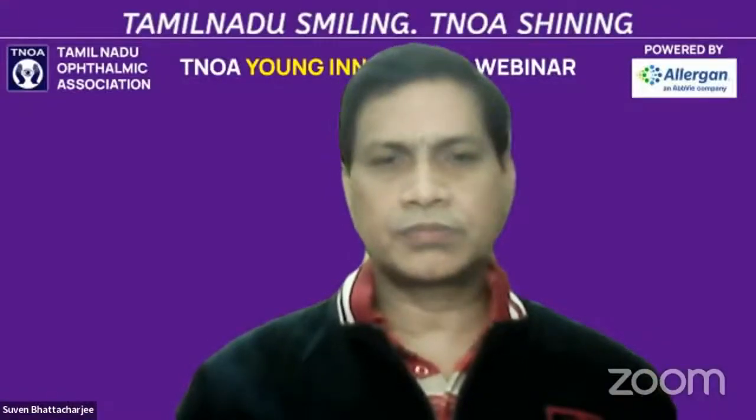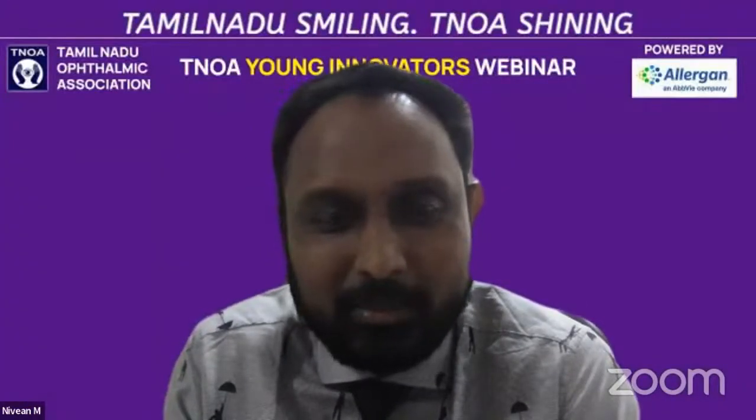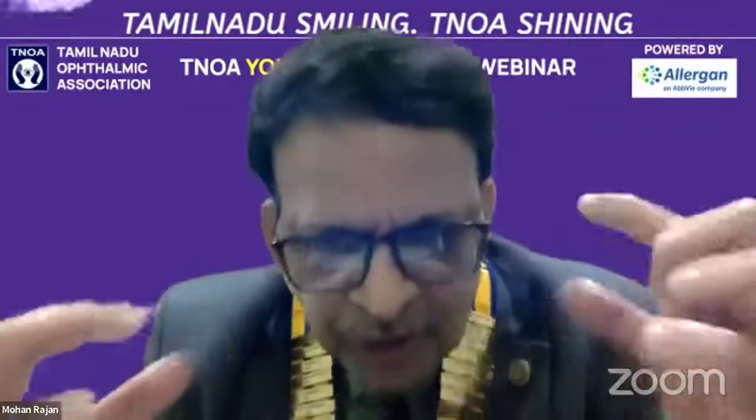But with the flange technique, the tilt is not in everybody's hands. Almost 60% of the implants have some unacceptable tilt and astigmatism in the flange technique. How's the tilt over here? Nivean? Tilt is almost nil, I think, yes, sir, because it's got a T. The 0-180 marking is appropriate. If you go a little off that, then there can be a tilt. It depends on the 0-180. I think slightly broader fixation. No, I think tilt will be very less.